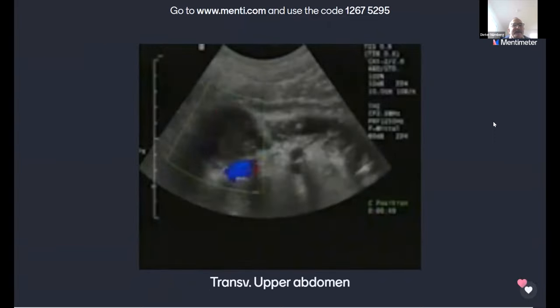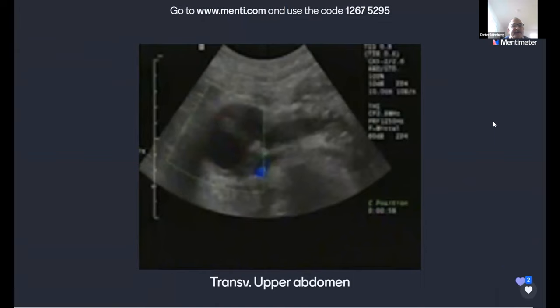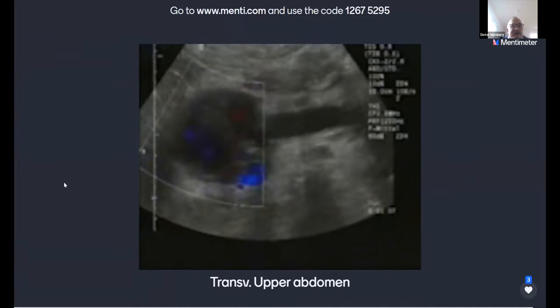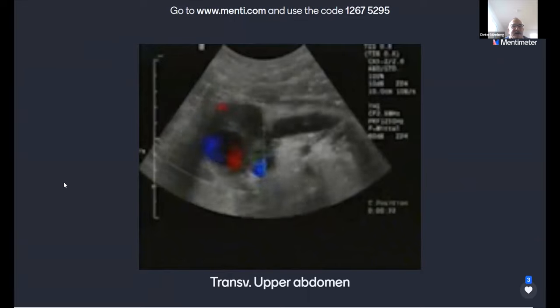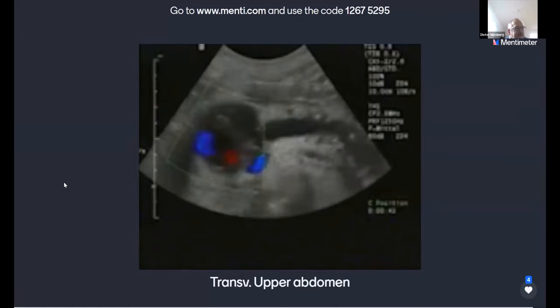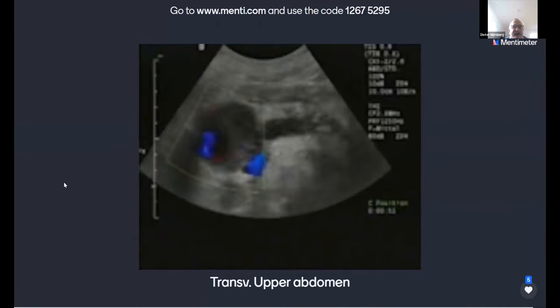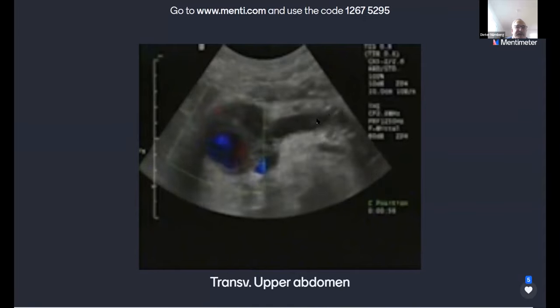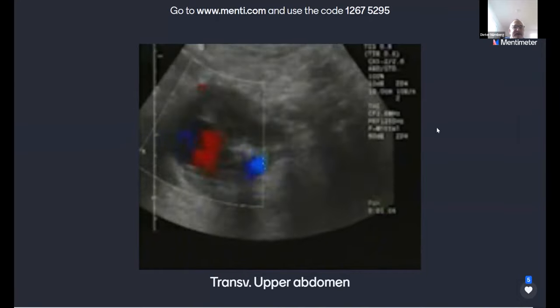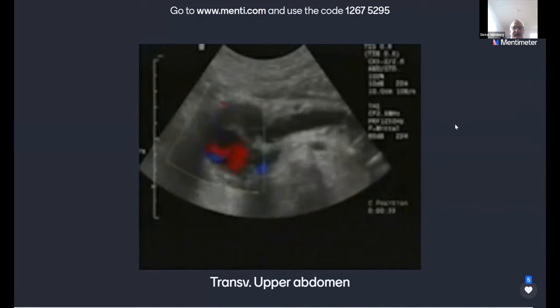It's a pseudoaneurysm. Yes, it's a thrombotic aneurysm. Before, it was a pseudocyst, and a vessel's wall was destroyed and made it a pseudoaneurysm, a typical structure in chronic pancreatic diseases, pseudoaneurysm of the arteria lienalis. And the duct you can see there is a pancreatic duct with calcifications in a patient with chronic pancreatitis. That is another situation of vessel diseases in the abdomen, complications in gastrointestinal diseases.